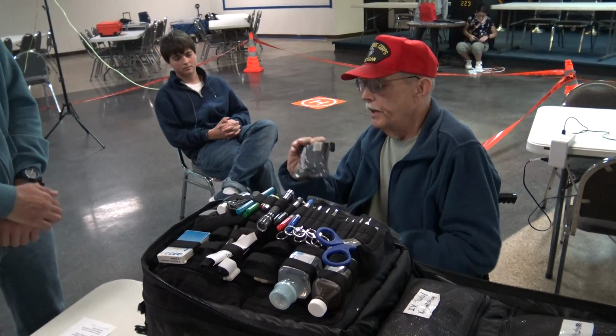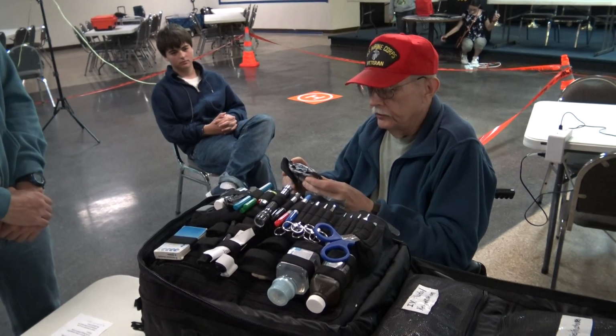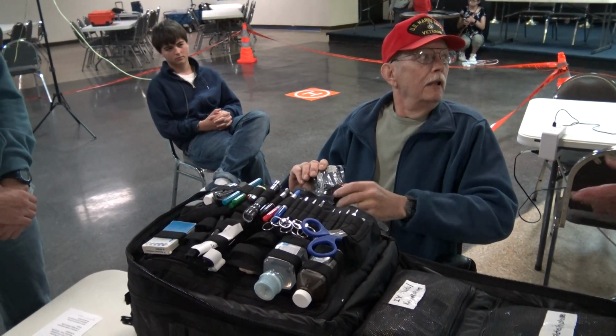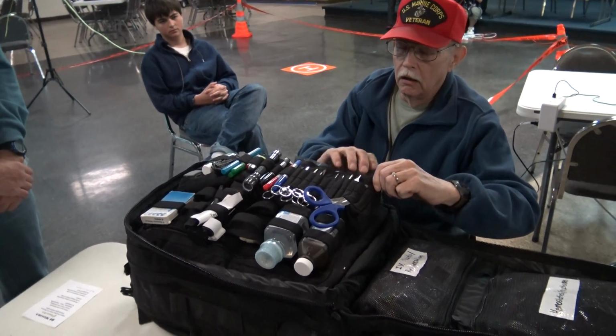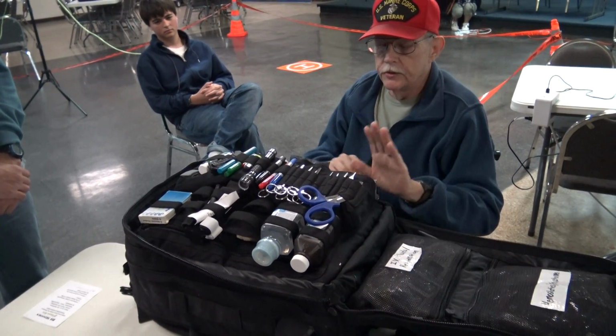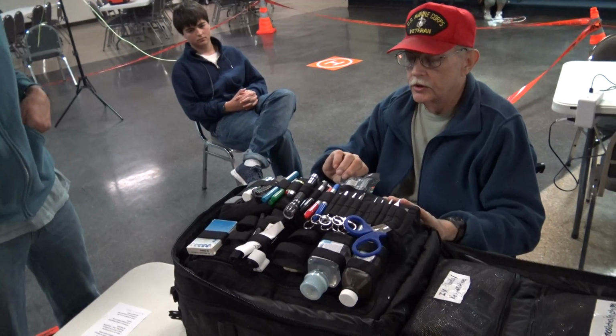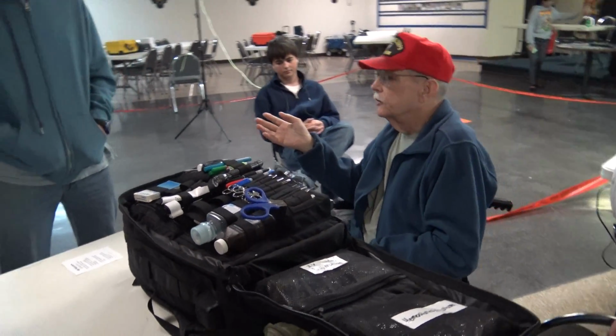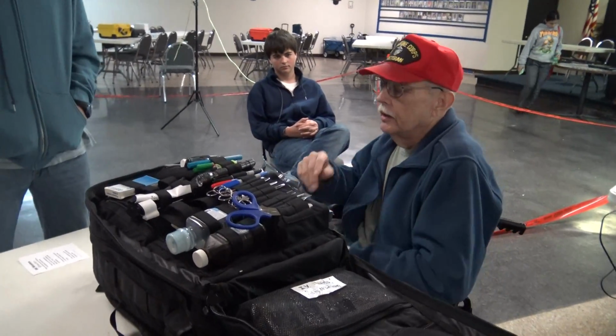Bandages, blood stopper bandages, but they've got a built-in tourniquet. Did you ever see them? Go ahead, go over some of the parts. And they come in different sizes. This is 4-inch, this is 6-inch. There are 8-inch ones for like chest wounds and things like this.